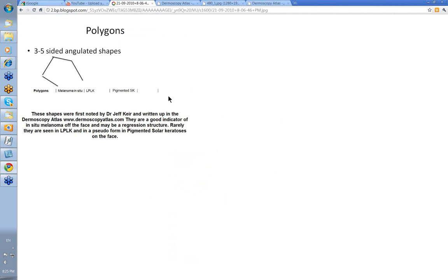So polygons, I think, are an important structure. I think they are genuine and they certainly exist, and if you practice in a sunburnt country like we do in Australia, the finding of these off the face on pigmented lesions on a sun-damaged back can be a good marker for an early lentiginous melanoma. Thank you very much.